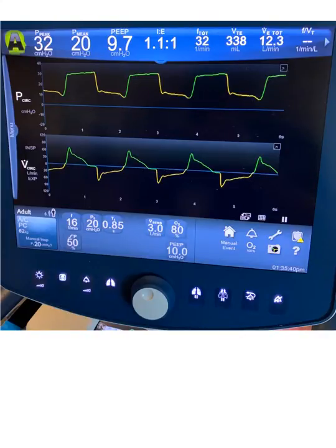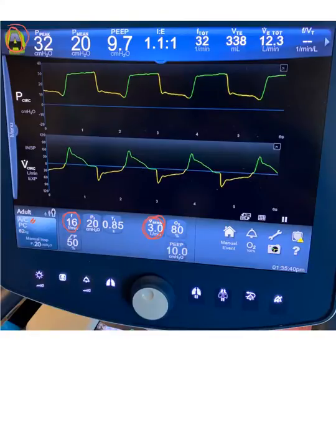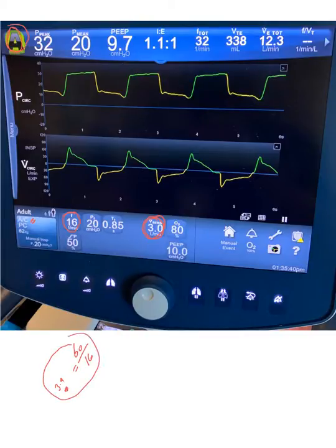I want to demonstrate the PEEP on the ventilator screen and quickly go over things we've learned so far. The trigger on this patient is assist control, as you see — AC. This particular breath is an assist breath. The ventilator is telling us via flow that the patient trigger is a flow trigger, and the control trigger is a backup rate of 16 per minute. 60 divided by 16 is almost 3.9 seconds.